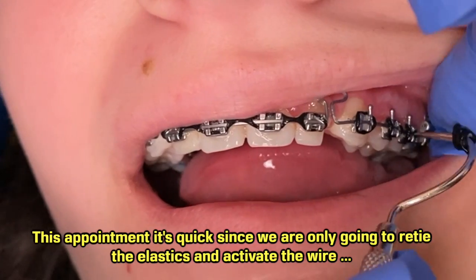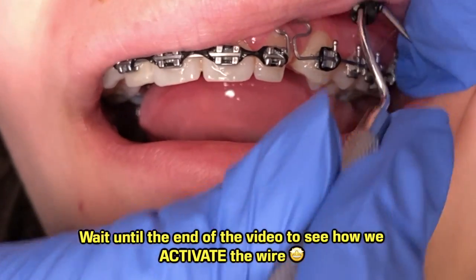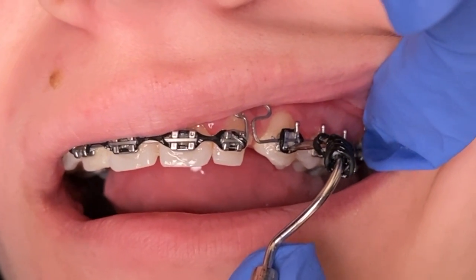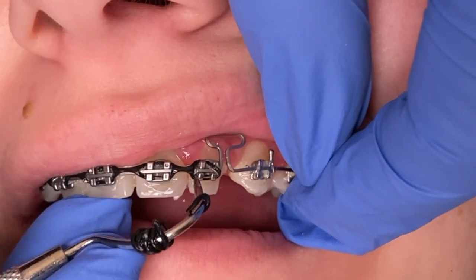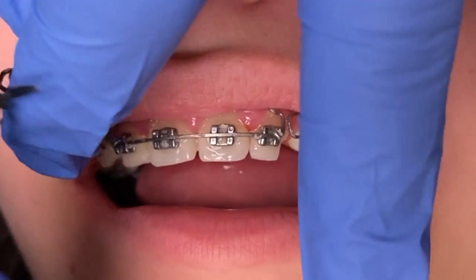Today, our patient, we are going to continue trying to close the spaces with our T-loop. We put this wire in last month, so today we're just gonna retie, we're gonna activate, and we're gonna have her continue to wear rubber bands.